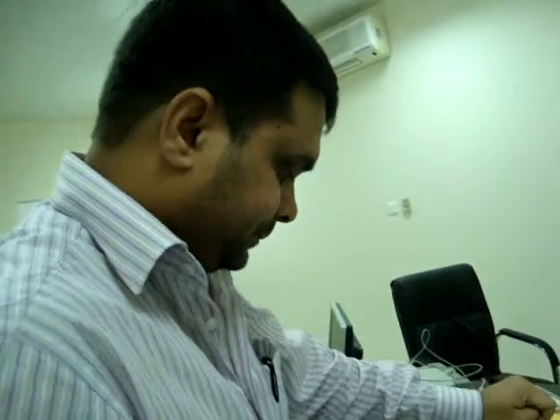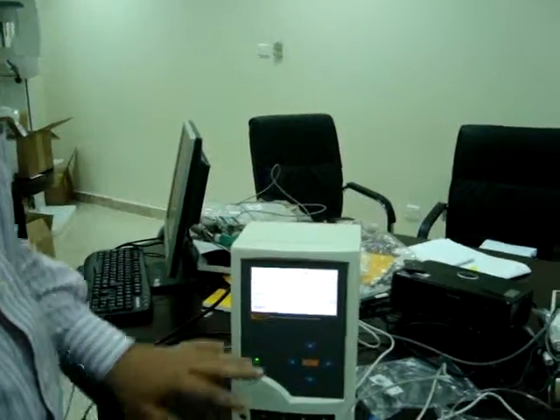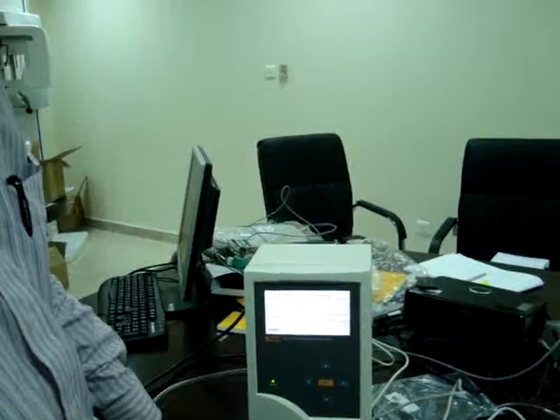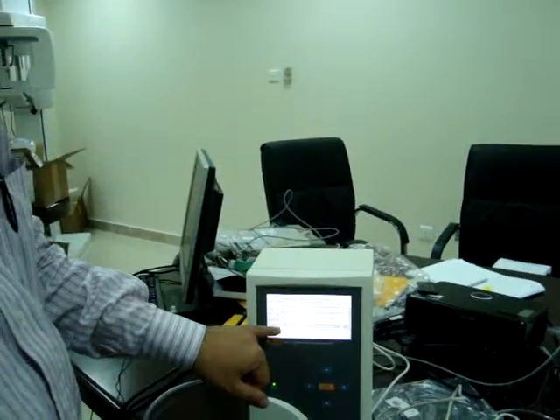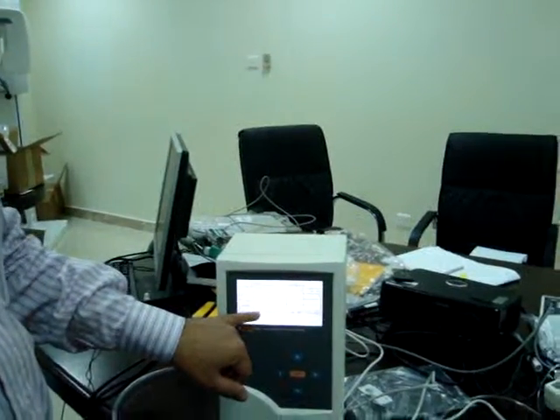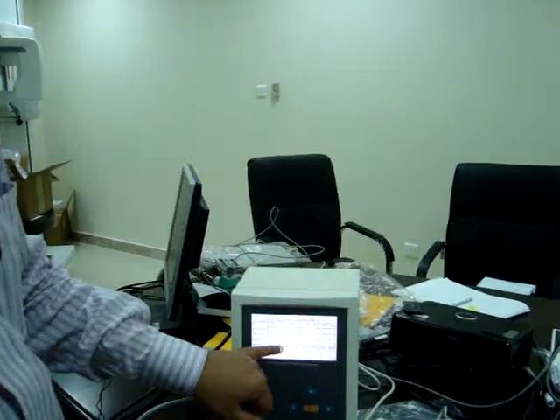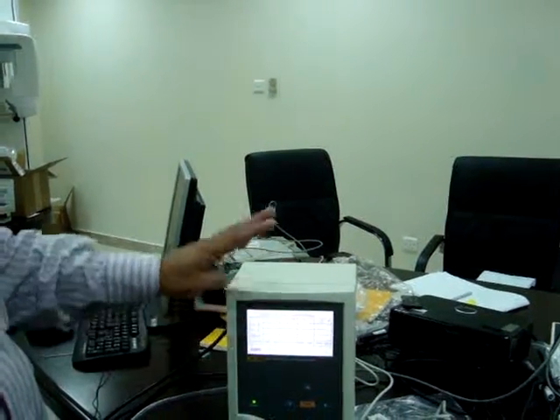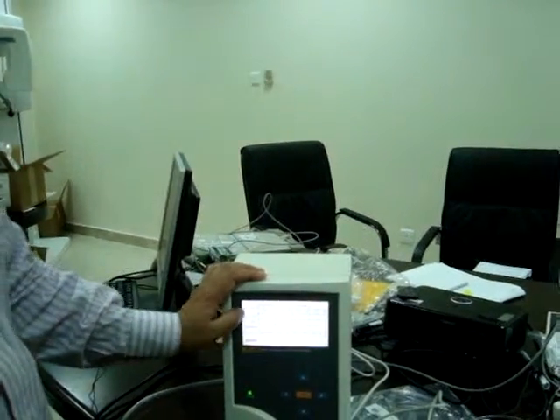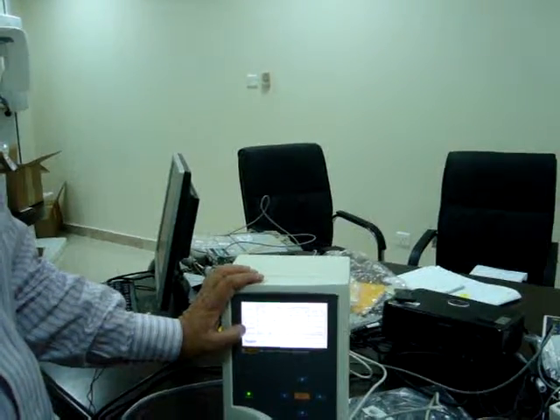Okay. So those are all the settings and prints. Now it will capture the start time once you start the test, and then you will see the time also. 3 parameters it measures: the flow rate, the volume and the pressure.